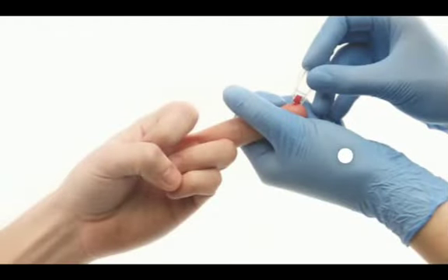The last way of sampling is the finger stick sampling, or finger prick sampling, which involves taking a very small amount of blood from the patient. And we said before that the type of the test and the number of the tests determine the type of sampling. It's over quickly and requires very little in the way of preparation, therefore reducing concern of anxiety in patients, particularly in children and nervous adults.